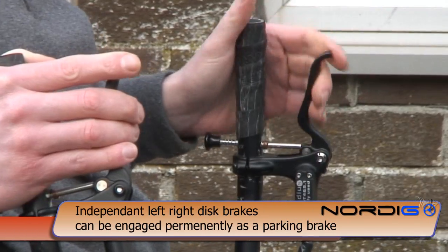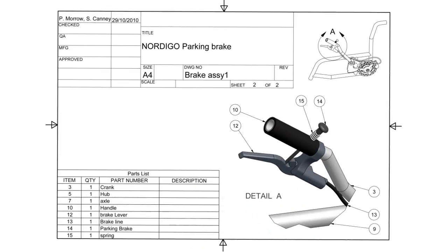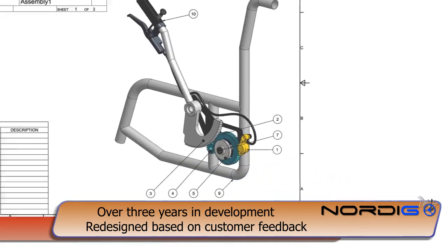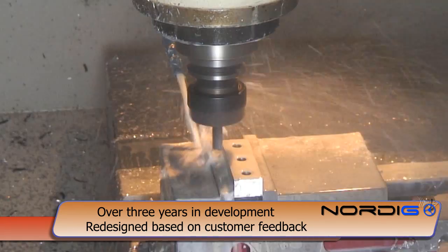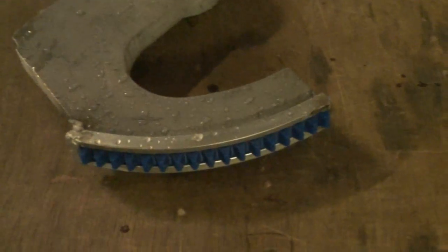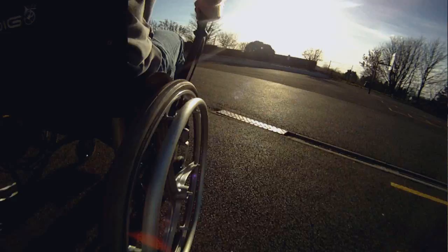The main brakes can be engaged permanently as a parking brake. We have spent two years developing, testing, and redesigning the Nordigo. We tried many different arm designs and materials to find the best balance between strength and lightness. In this latest edition we have shaved a further 1kg off the total weight to make this the lightest lever propulsion system on the market.